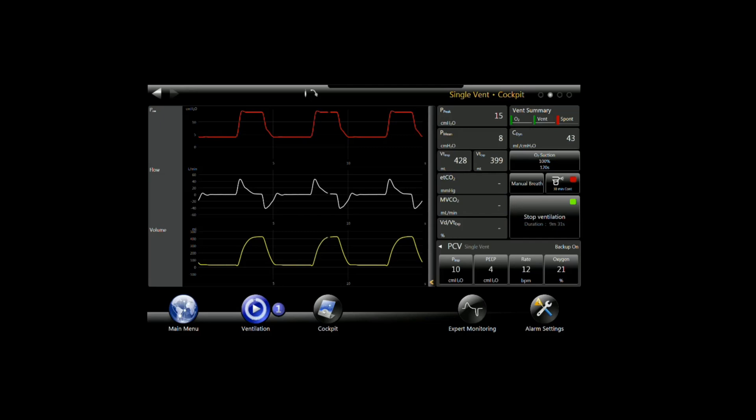Before we do anything with capnography, I want to show you a couple of things you need to be aware of when you're setting up. I'm going to go out to the main menu page and hit the button in the lower left hand corner.